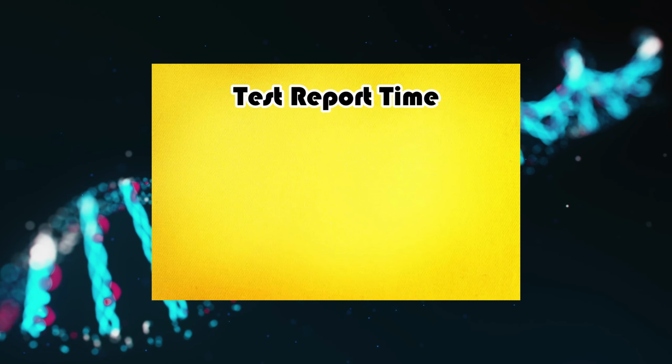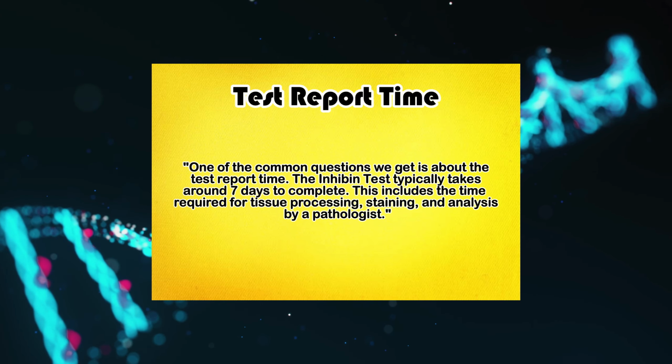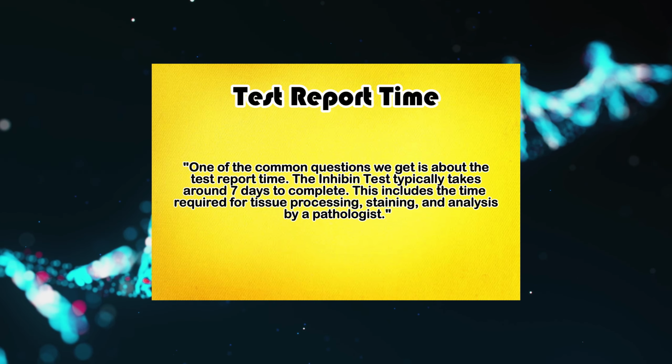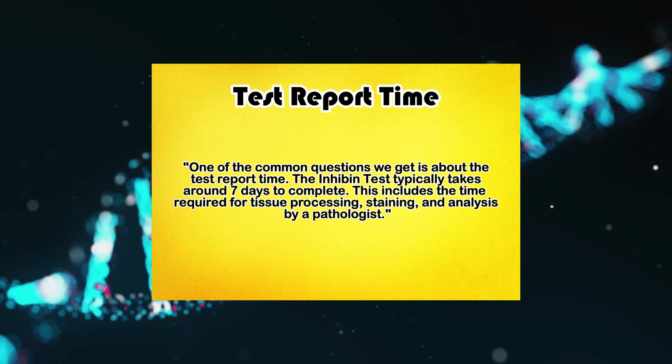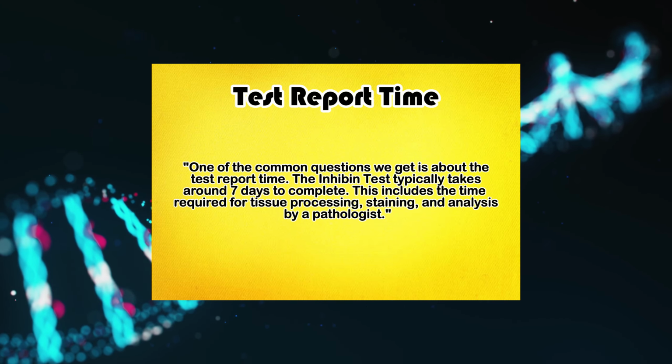Test report time. One of the common questions we get is about the test report time. The Inhibin test typically takes around 7 days to complete. This includes the time required for tissue processing, staining, and analysis by a pathologist.